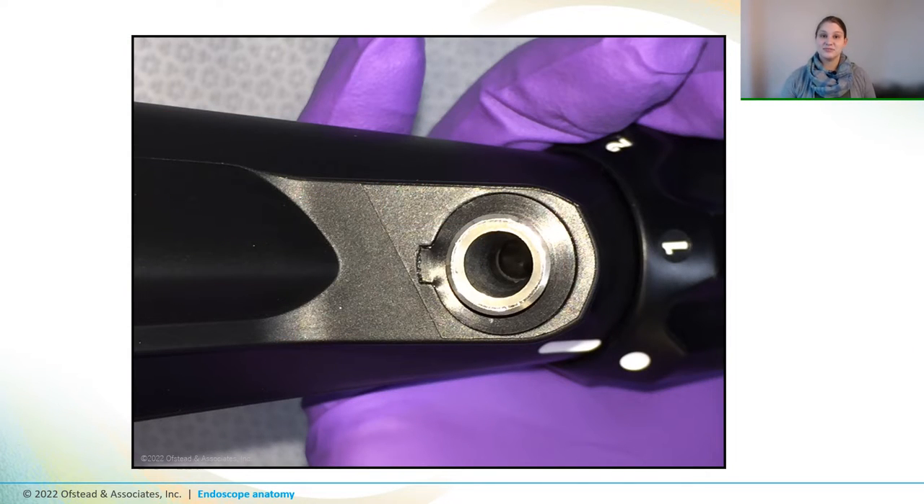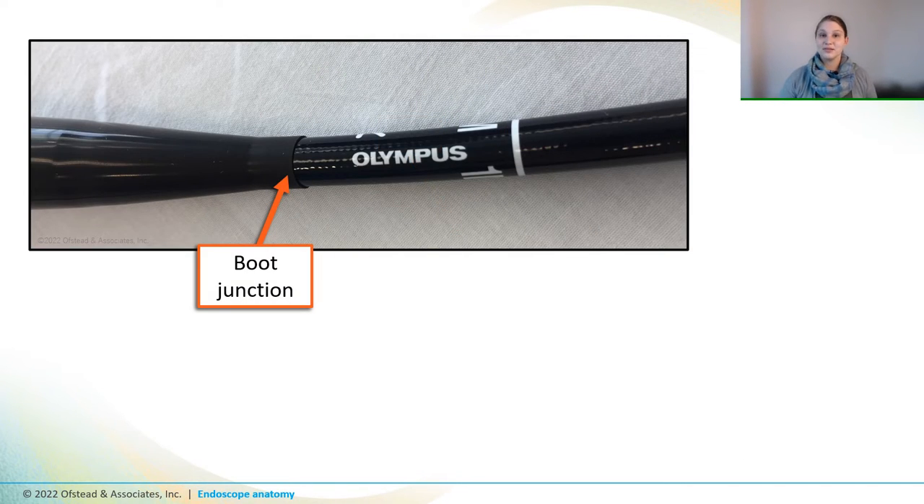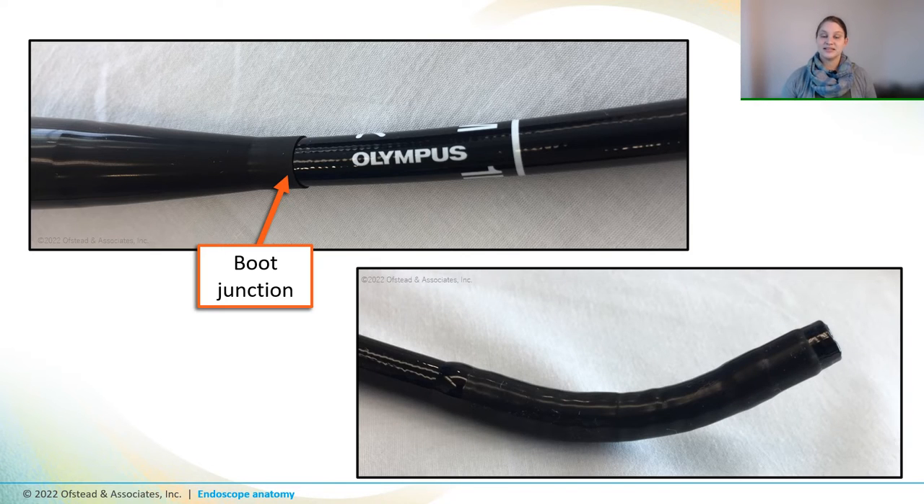And here's a closer look at the biopsy port of a brand new colonoscope. You can see that the port itself is shiny and metallic, and the base of it is held in place by a black piece called a grommet. And this photo shows an example of a gastroscope boot junction, which is where the control handle attaches to the insertion tube. And this is the bending section of the same scope, which is controlled by those knobs that we saw on the control handle.